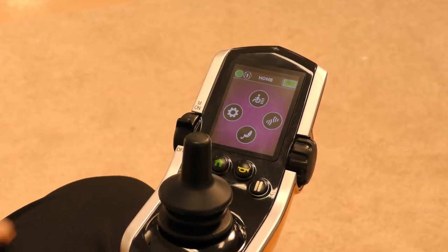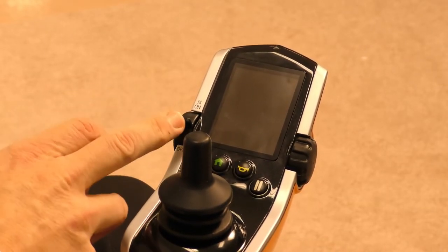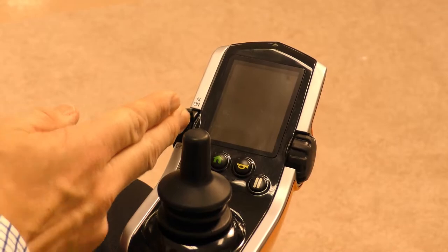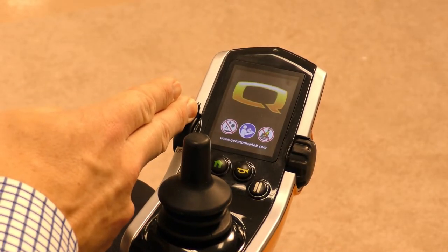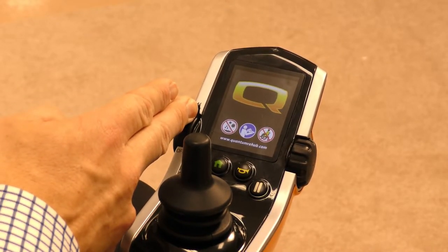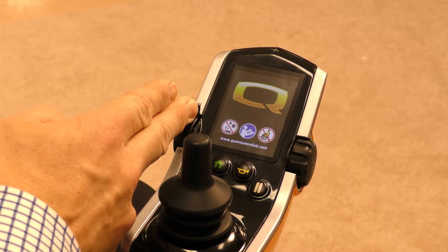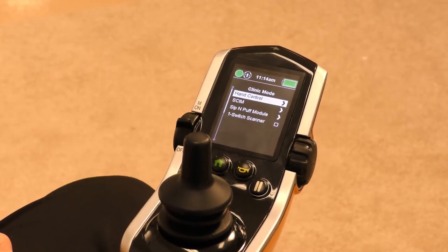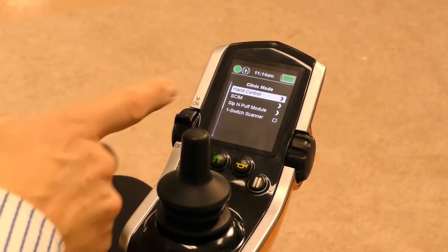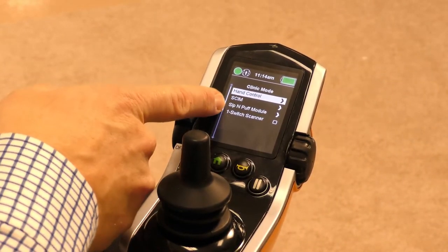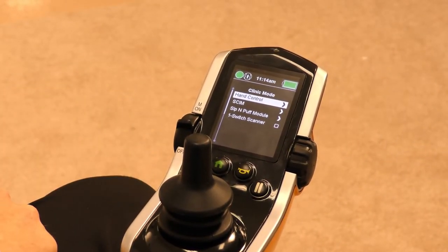To access clinic mode, the chair is turned off. You hold the on switch forward for approximately five to six seconds. Once that comes forward and the screen comes on, you'll see it says clinic mode, and it gives you the options of using any of these modules.